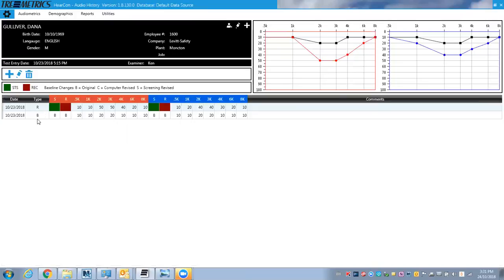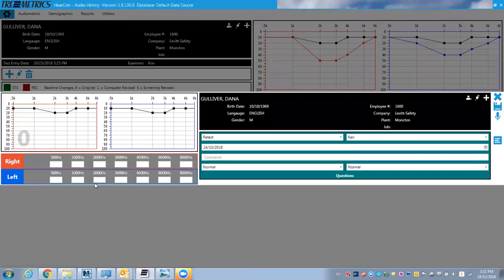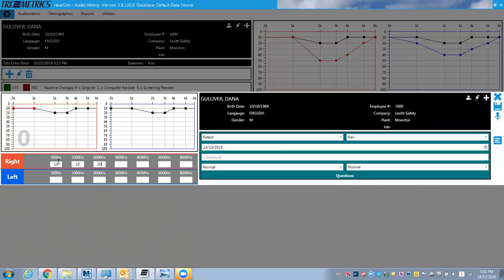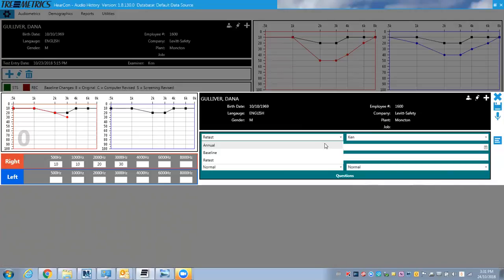Now I've got some information from the past on him or if I have some past information I want to add, I can click here and actually manually type in different results from the past and I could mark this as an annual baseline or a retest or a normal. So I won't do that right now. I won't add it in, but all I would do is add that in and I would hit save here to add it to the list.